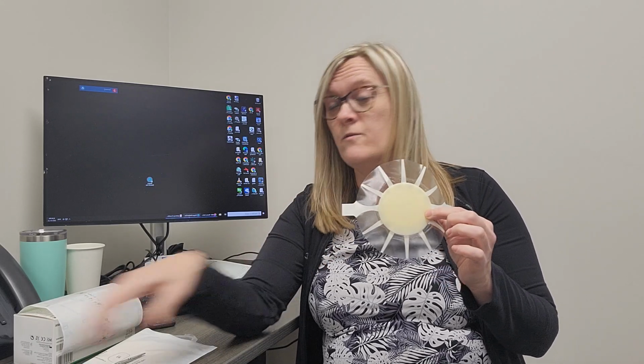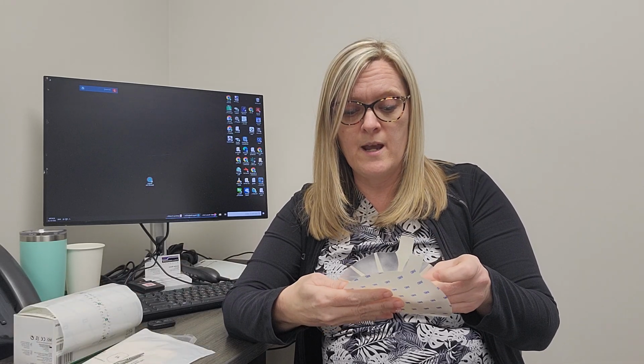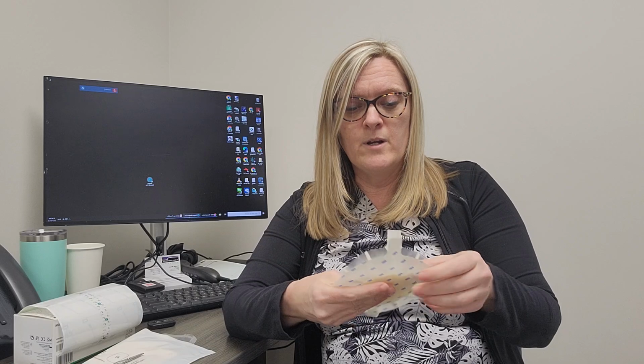So what I want to use quite often is a non-adherent foam. If you don't have these lovely fancy foams, which I know are not on the catalog currently, you can actually make this. How do I know this? Well, because I've been a MacGyver for many years too.